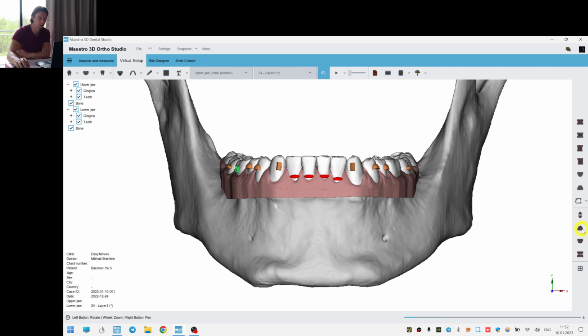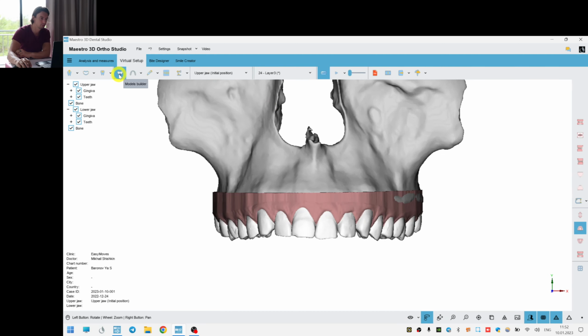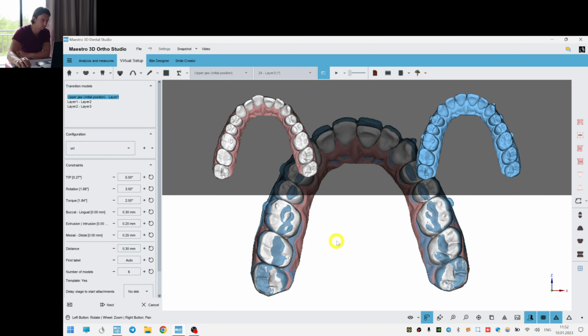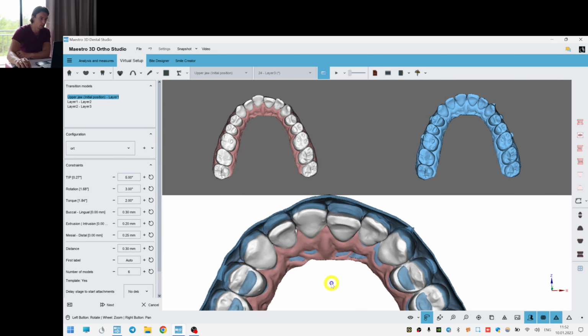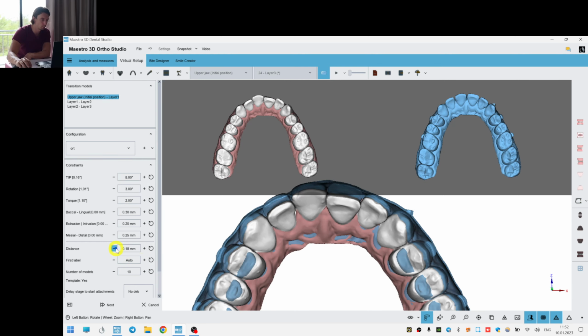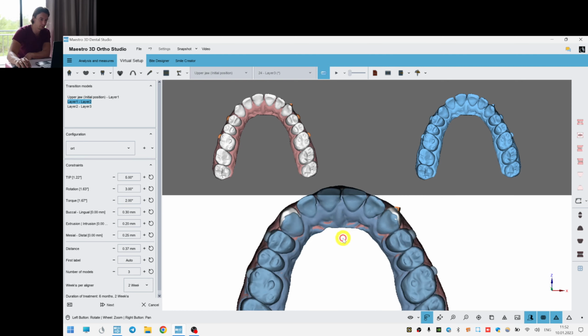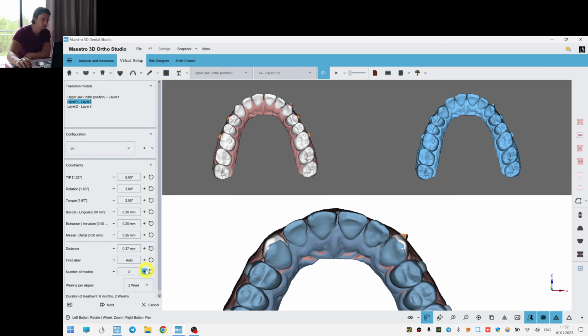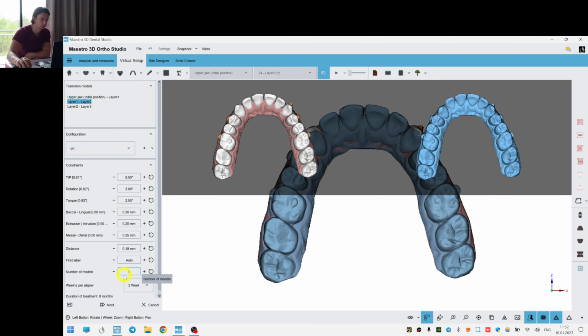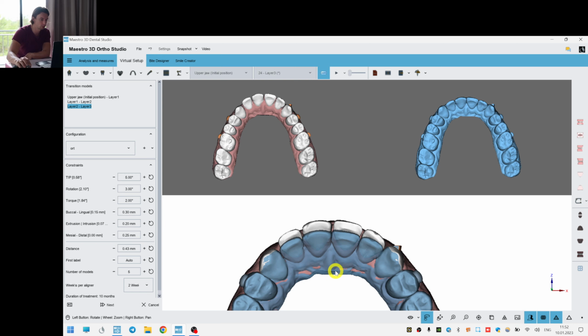And it would be great if we make the same quantity for the upper. I prefer to match the numbers between lower and upper arch. And here we should make more and more aligners. 0.18 is fine. And I would definitely use Endura FLX for this case. We need a good material. Here it's fine, 0.22. And here we have retraction and some intrusion.